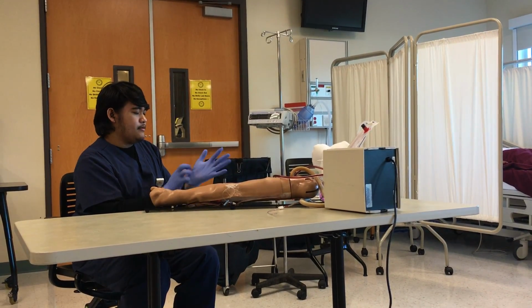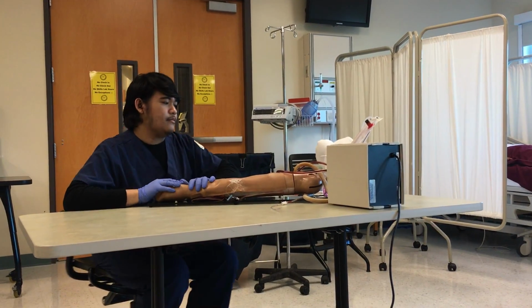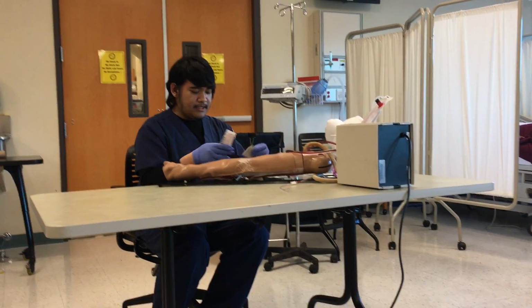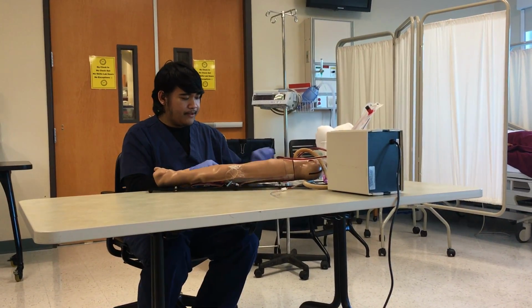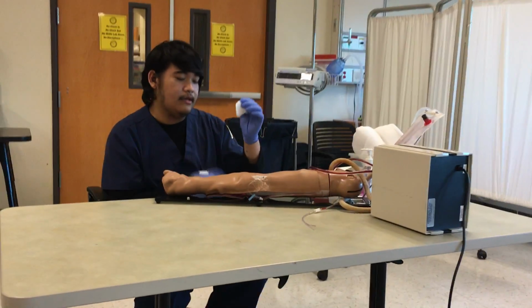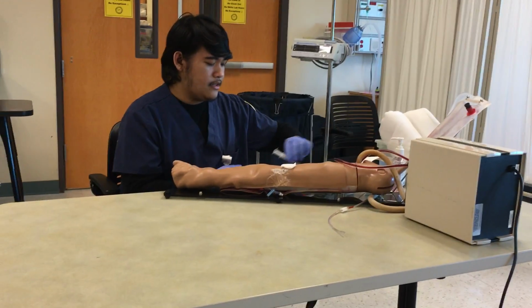I'm gloved up, and I'm going to position the patient's arm. I'm going to set up my equipment. Since I'm a lefty, I'm putting everything on my left. I would ask the patient if I could place this under his or her arm. There we go.